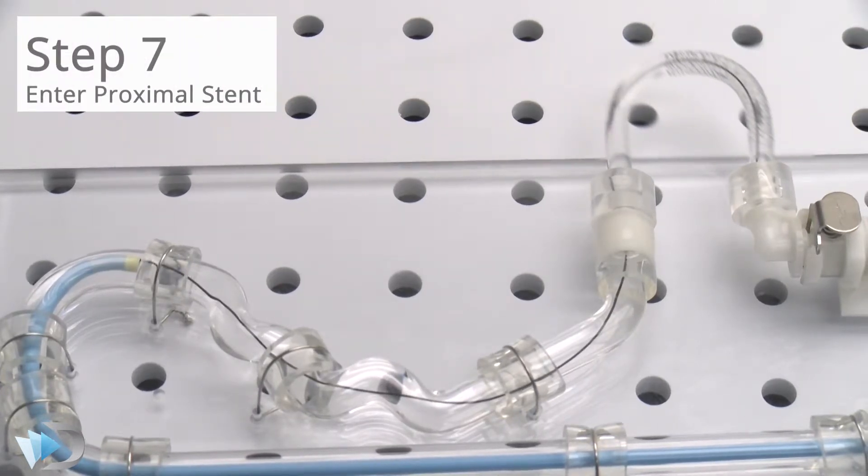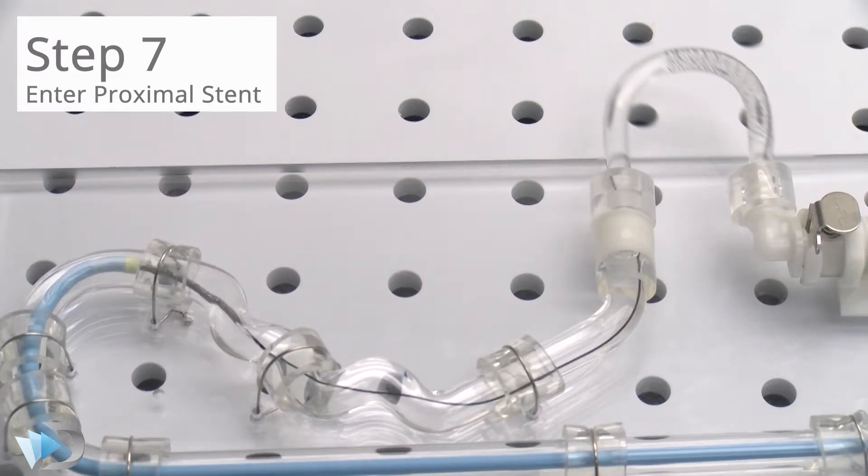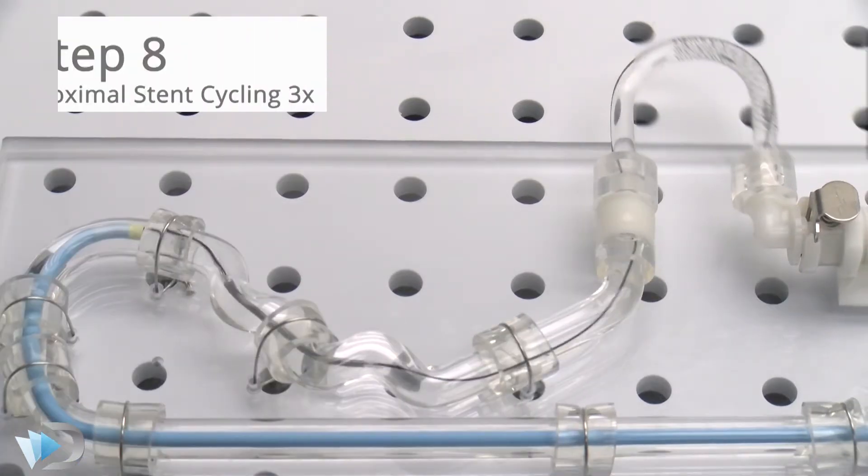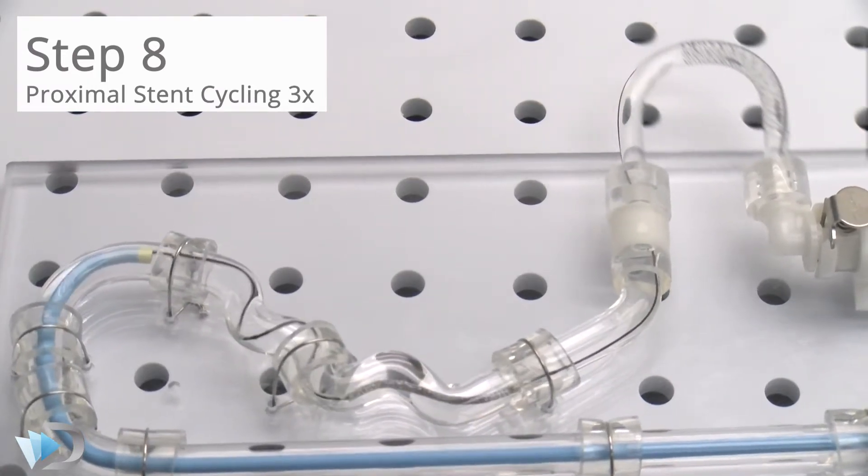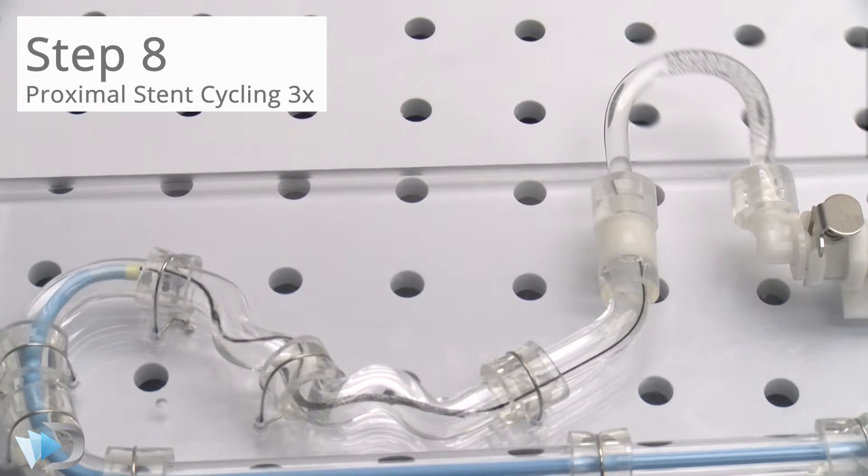Next, the proximal stent is introduced into the system, tracked through the path as before, and advanced into the proximal deployment site of the curved mock vessel.